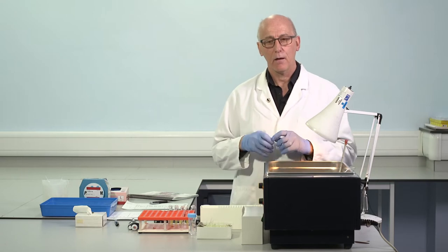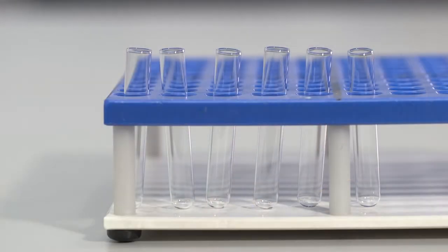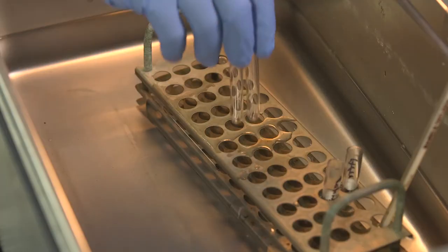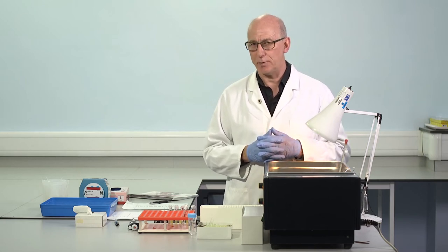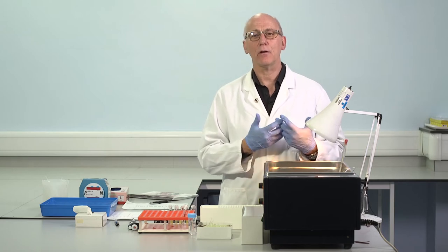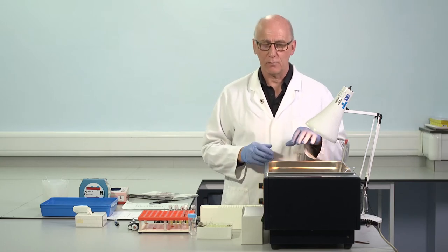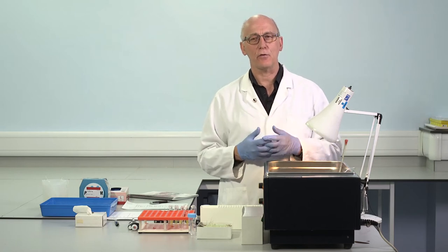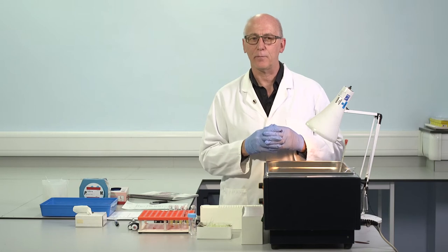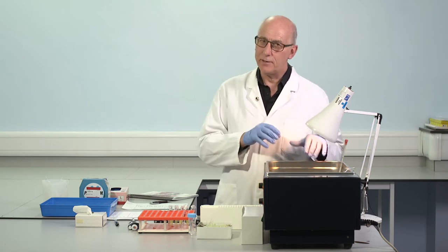The testing itself. For manual testing, should be in glass test tubes. These are borosilicate, and the nature of the glass tube is not so important, but I think it can have some impact on the results that we obtain. For APTT, for manual testing, I think it's important to test in duplicate. The precision of manual testing is not as good as the precision of APTT testing on automated systems. It's more variable, so we expect to see a higher CV for manual testing. For an internal QC material, it's going to usually be in the order of 5 to 10%. So it's an acceptable level for patient management purposes, but is not at the level of 2 to 3% that might occur on an automated analyzer. Therefore, we need to test in duplicate.